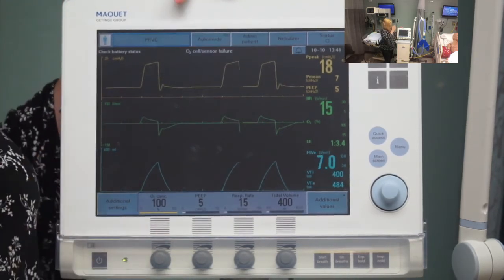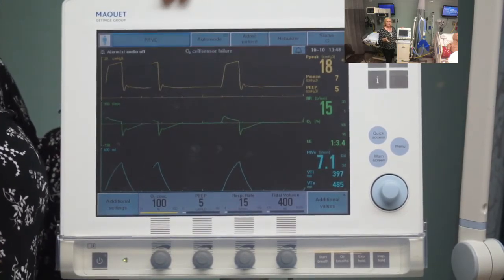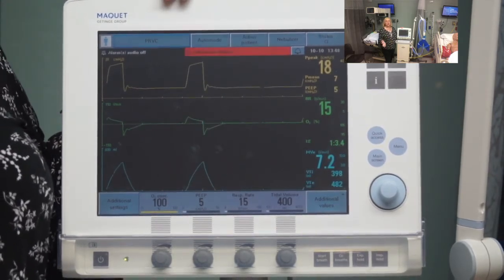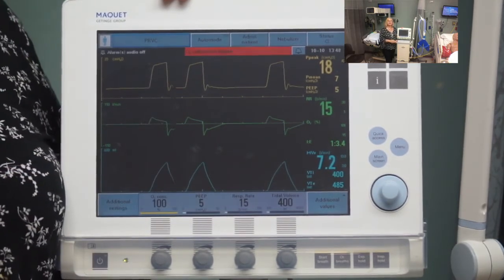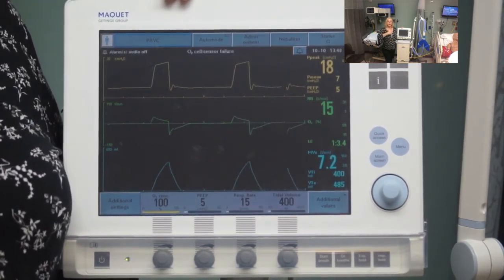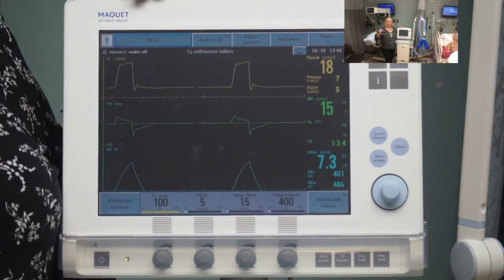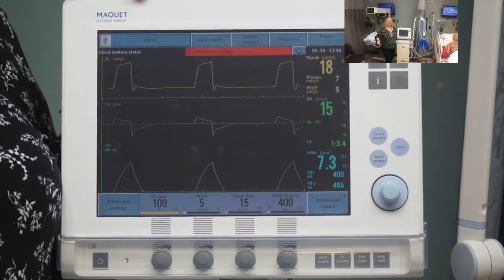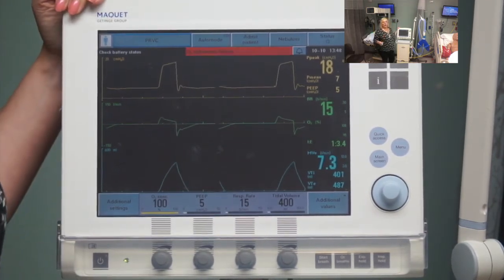And what I was talking about with what makes this mode great, and this is also what makes pressure control a good mode, although we don't have the volume guarantee, so there's the opportunity for barotrauma or under ventilation. What makes this mode great is this flow waveform, and the reason that that's a great waveform is that flow starts out really fast when you're anatomically at the large airways, and as you go to the distal or the smaller airways, it slows down, which keeps the flow nice and laminar and enables you to get more bang for your buck and more volume with less pressure.